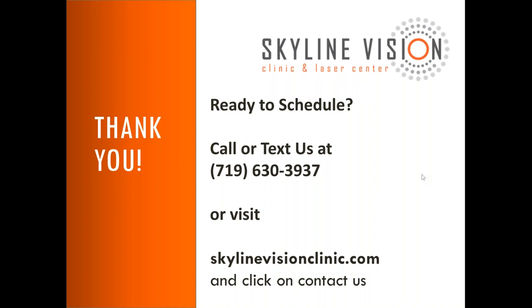After cataract surgery, the vast majority of patients will have a secondary film called a posterior capsular opacity. The capsular bag is that part of the eye where we remove the cataract and where we then insert the intraocular lens. The capsular bag has a certain size, and when we put an implant in, the implant is much smaller than the space that the capsular bag occupies.